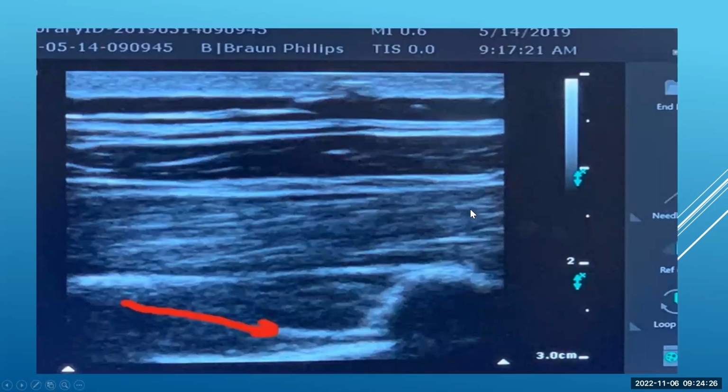Okay, this is the paravertebral block. This is a nice image of that. And again, it's just highlighting the benefits of ultrasound, and that we can appreciate the fascial planes. They're hyperechoic. This is more hypoechoic. Again, another fascial plane. We can see the transverse process, and it's kind of squared off here. We have nothing underneath that because it's not an X-ray. That comes back anechoic. But then we can really see this line right here that's hyperechoic. And then also this other one with the red arrow by it. That's the costotransverse ligament. And this would be the pleura.